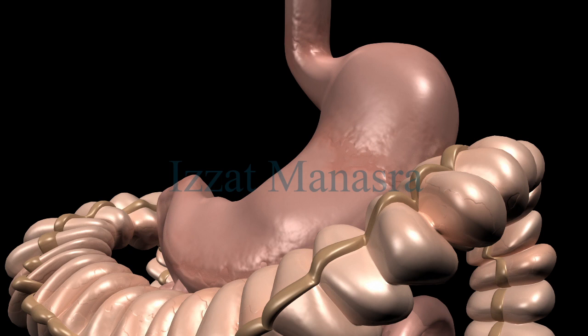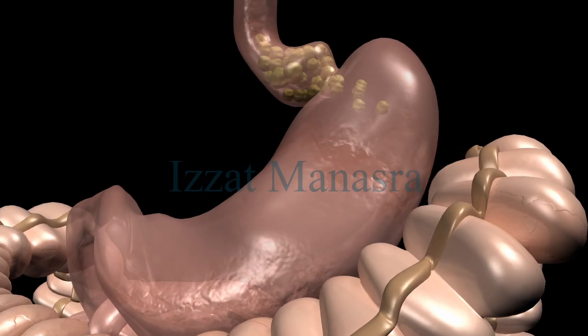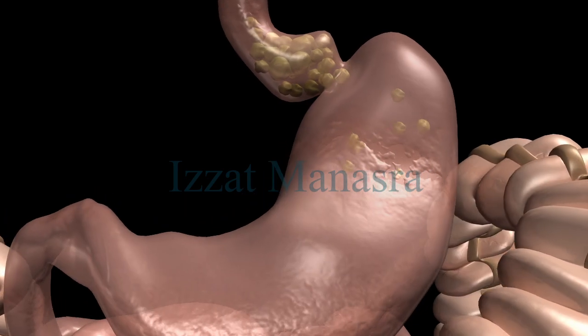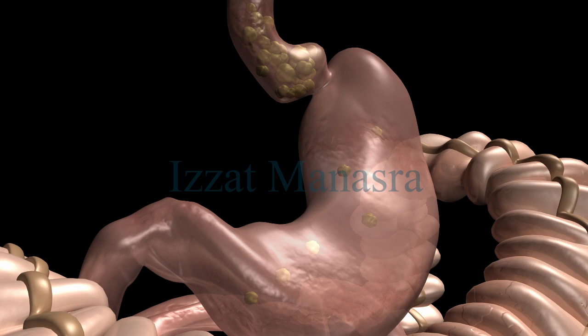Banding techniques are restrictive procedures. They help decrease food intake in two ways, by shrinking the stomach to a small pouch and by making a tiny opening from the pouch to the rest of the stomach. Food moves slowly through this opening. These factors make you feel full quicker and for a longer time.